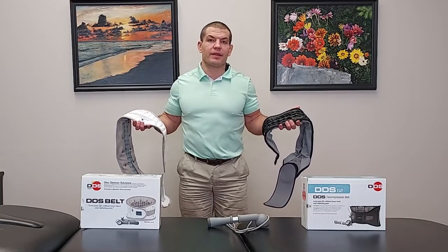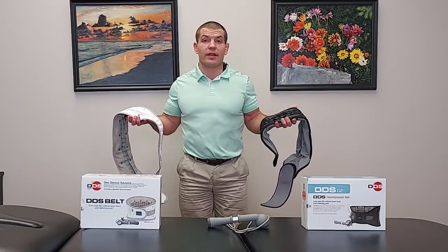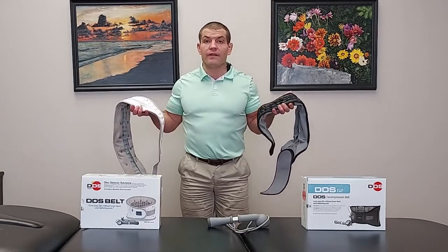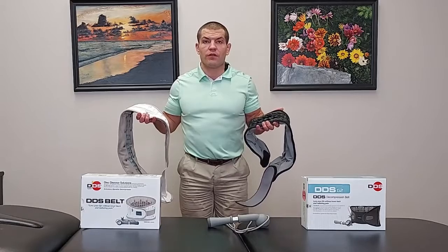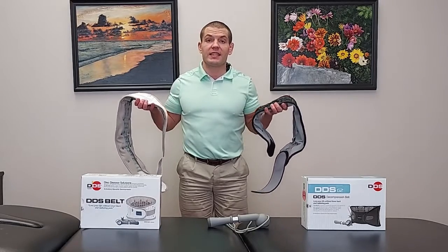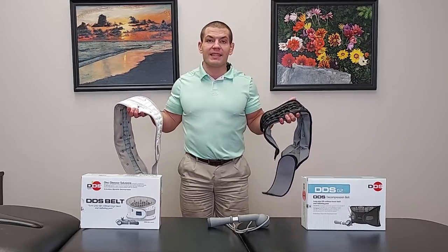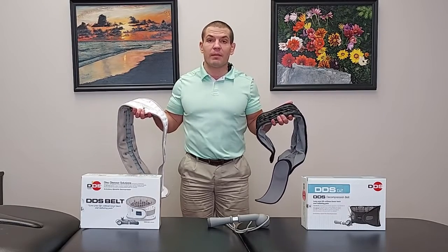Which back brace is better — the DDS-300 or the G2? Both of these braces are fairly similar models for degenerative disc disease, herniated disc, and sciatica, and they're made by Disc Disease Solutions.